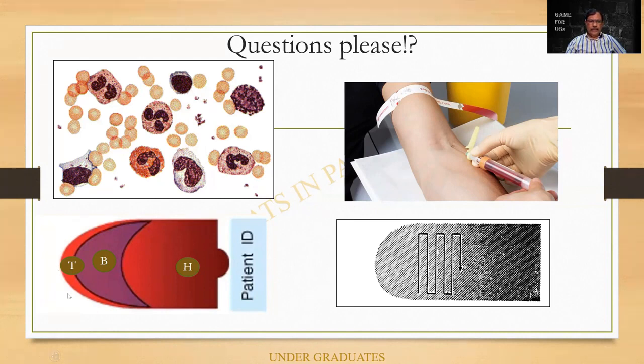The parts of a smear, I marked it over here. This is the slide, and in which I should have the patient's number. Initially, a drop of blood is being placed, and from that a smear is being made. This is divided into three portions, namely the head, the body, and the tail. The head is a dense portion in which there is a lot of overlap of the cells. Morphology could not be made out.